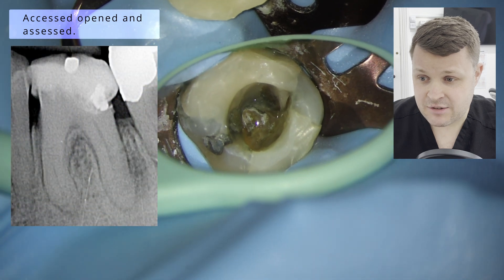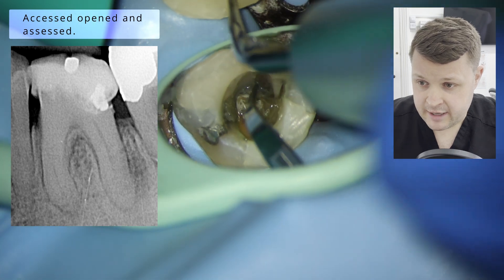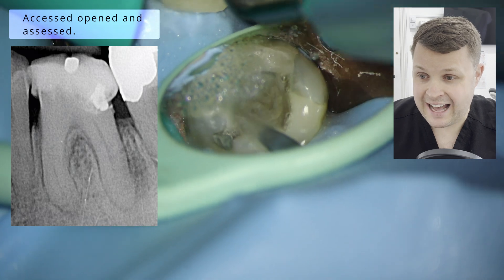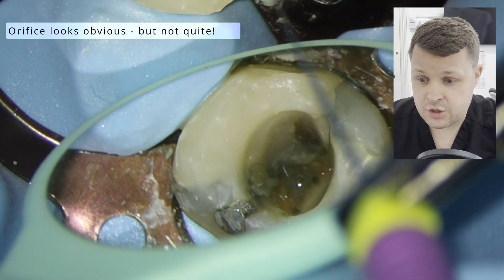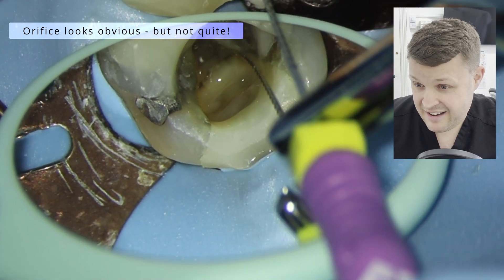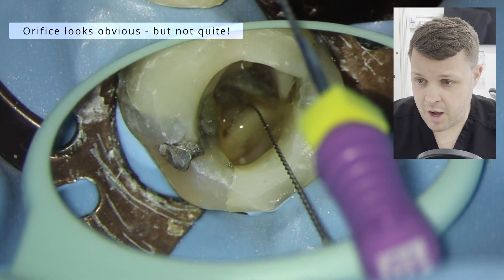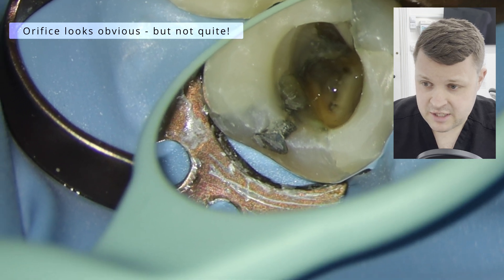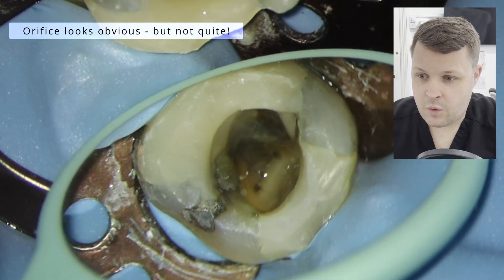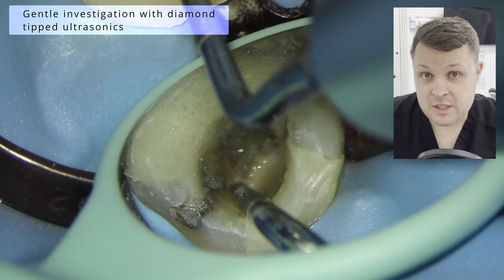You can see by the x-ray here that there's no obvious canal space on the radiograph. I've removed the old filling, put a new composite filling in, and I'm just using a high-energy ultrasonic tip here just to clean out most of the canal floor. In here, it looks like the canal orifice is pretty obvious — I had the sort of drop in the two canal orifices that you can see here. But the hand file just isn't quite dropping nicely into an obvious canal.